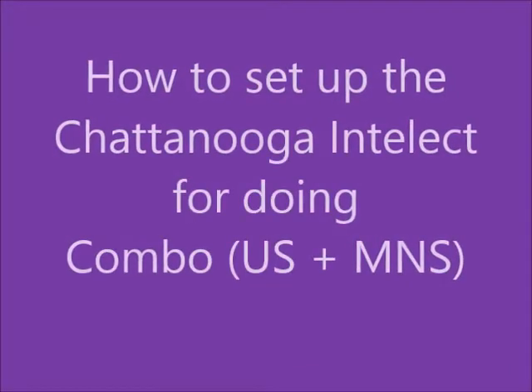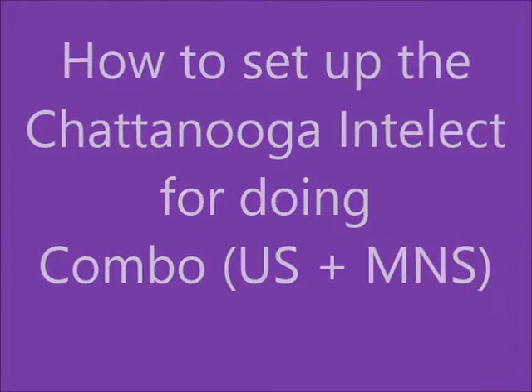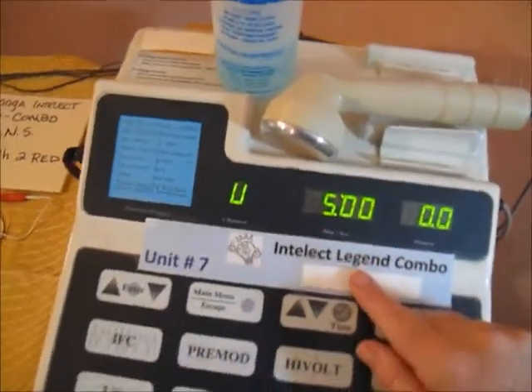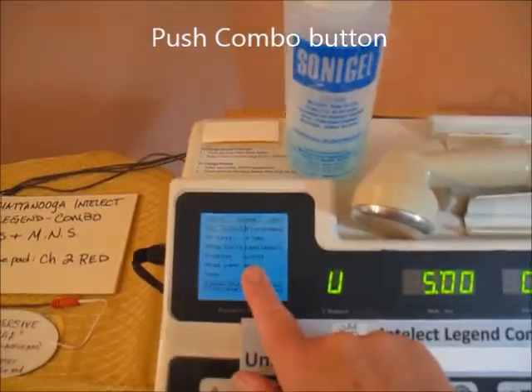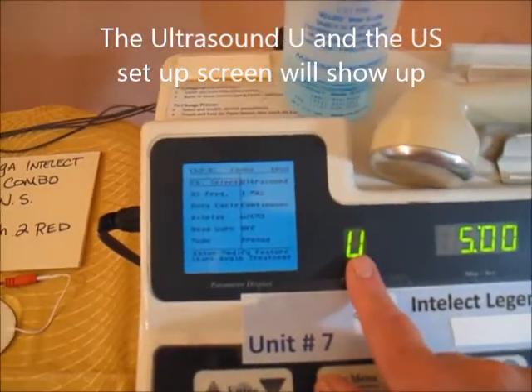Using the Chattanooga Intellect, we're doing combo with ultrasound and motor nerve stim — pre-mod or high-volt. We're going to do combo now with the Intellect Legend, made by Chattanooga. Push the combo button here and the screen will show up with the letter U.